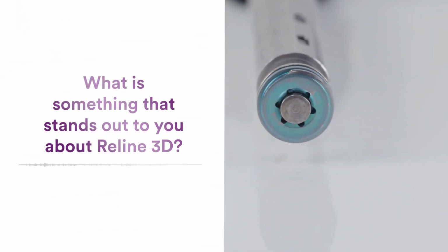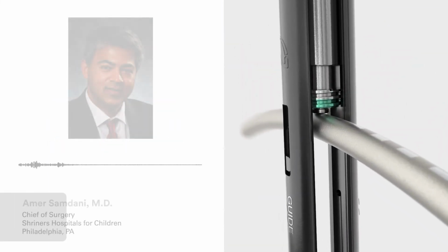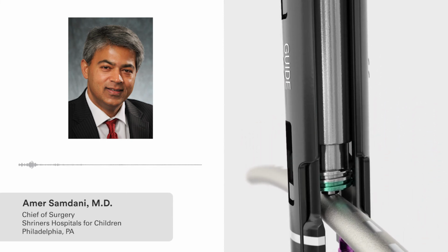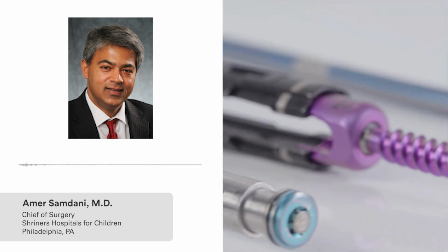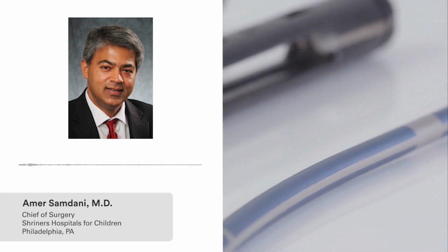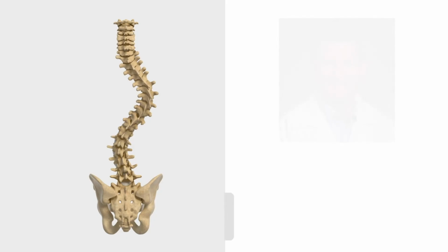What better way to distribute loads than to have guides attached to each anchor point that you have, and have them attached bilaterally. So now you're able to distribute load rather than having it on one screw or two screws or three screws. You have it essentially distributed throughout the spine, and that allows, first of all, to maintain your bone-screw interface and your screw integrity, and then secondly, to gradually get correction.